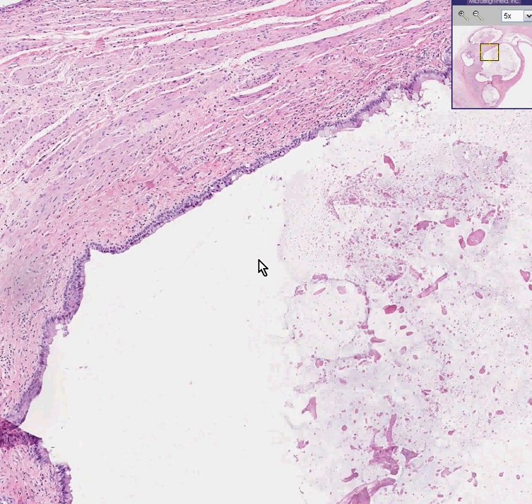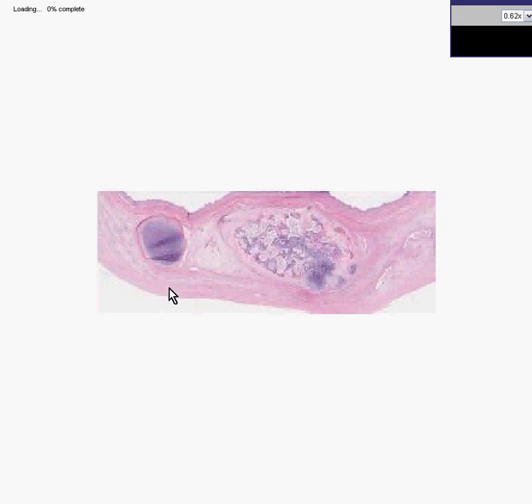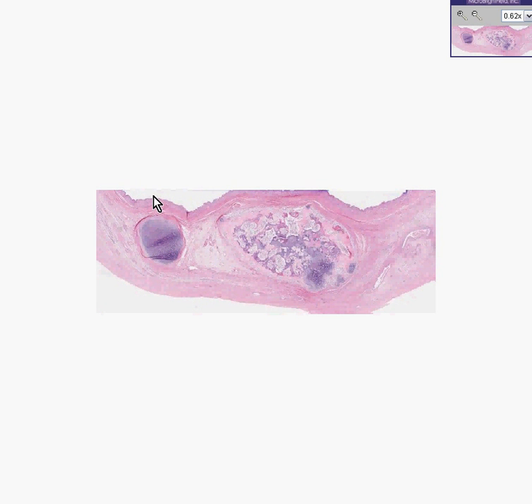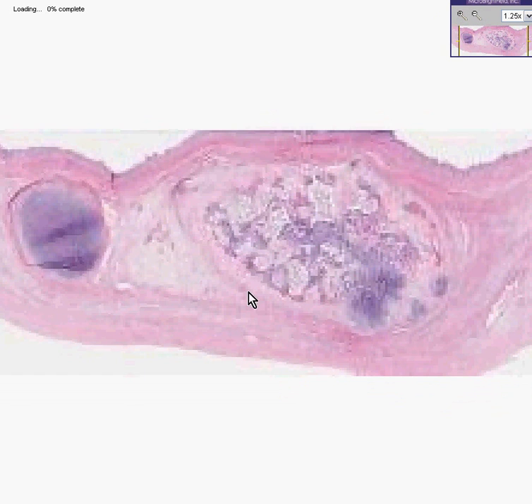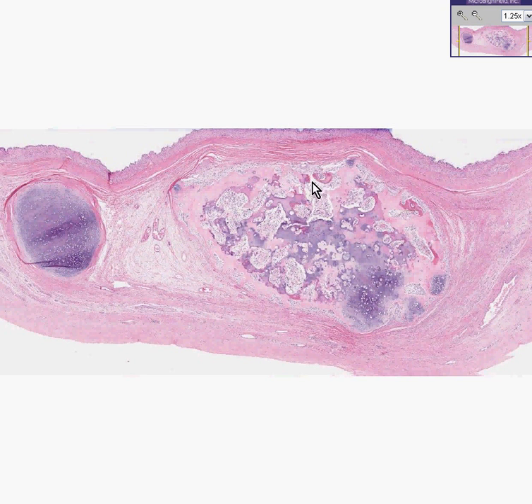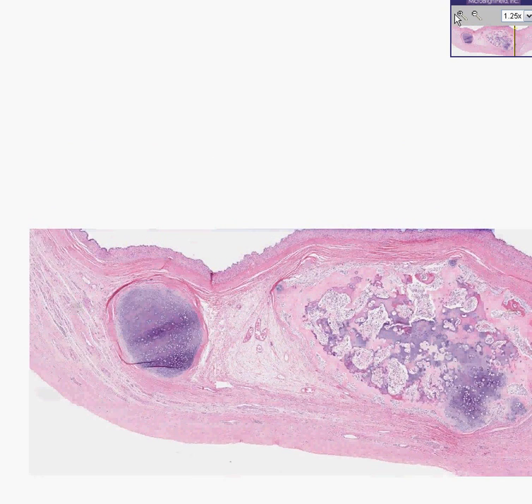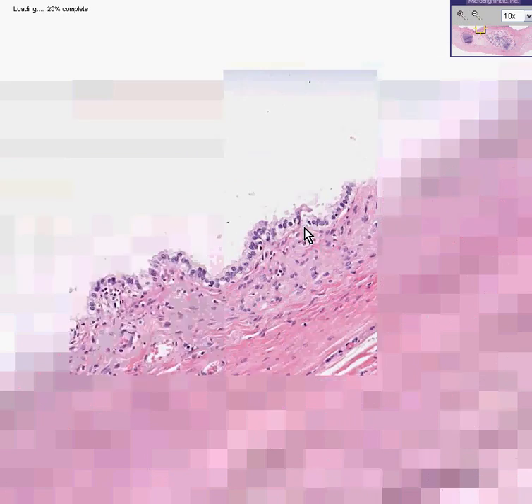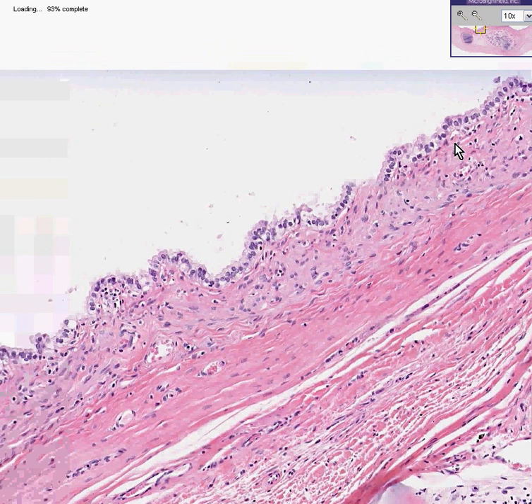Here's another section through the teratoma in which, even at this power, you could see cartilage. You could see some type of epithelium up here, and you could see either cartilage, possibly calcified, or perhaps even bone. This is classic textbook normal hyaline cartilage, perhaps either ossifying or at least calcifying in certain areas. This is all very mature tissue. In addition, here is some more epithelium and smooth muscle. This epithelium could perhaps be respiratory, but it's at least a nice uniform columnar type of epithelium like you would see in any mature organ.